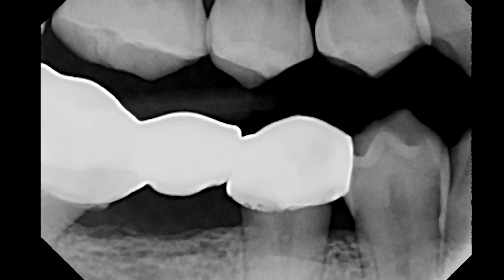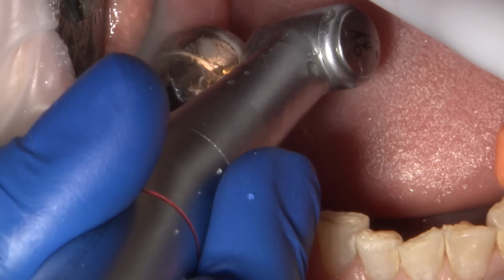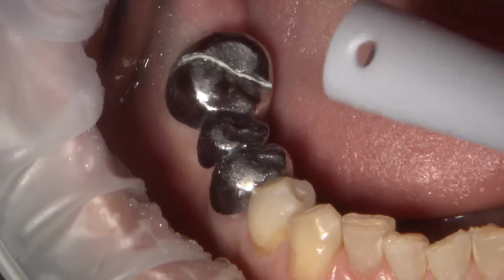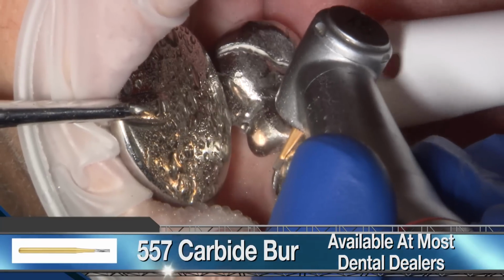The X-ray confirmed that there was an oblique cut made distal to 29, and that was puzzling to me. Not until I removed the bridge did I understand that this was the dentist or the technician's way to deal with the draw problem. So here I am cutting off the bridge using a 557 carbide burr.